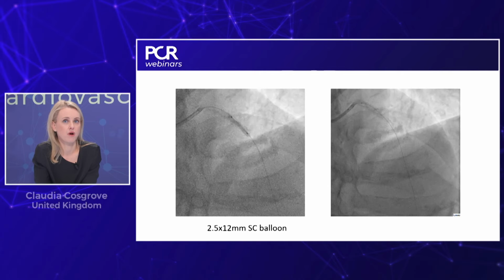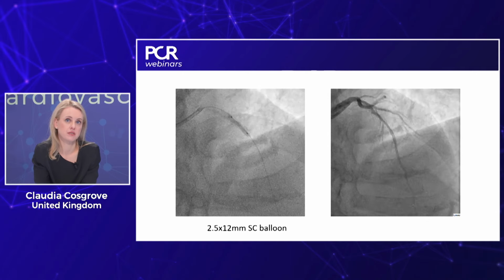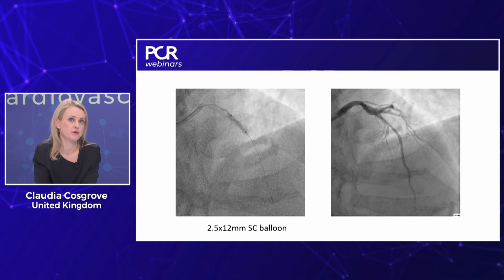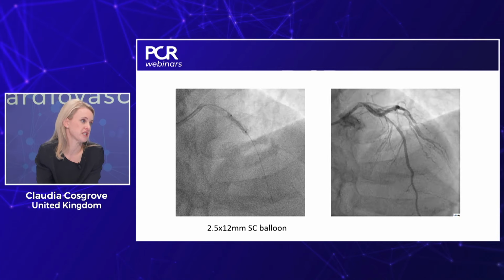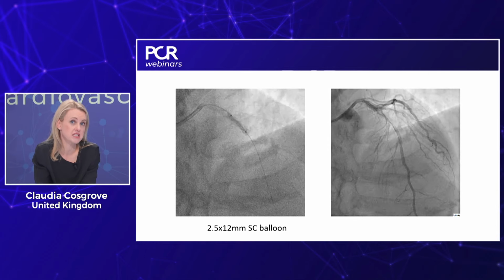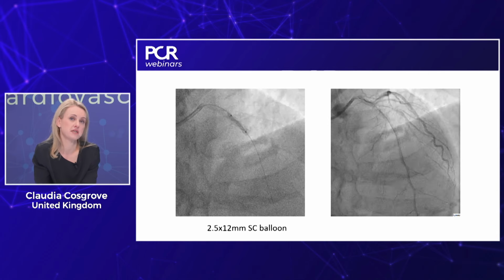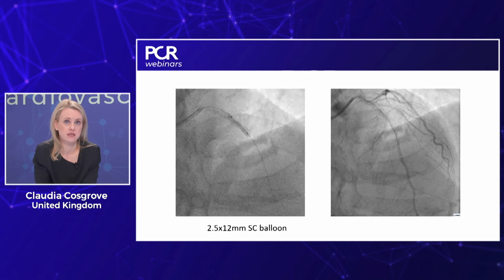I think you can see on the angiogram on the right that there's at least moderate calcification, based on the angiographic appearance of calcium before the dye enters the artery. I think that 2.5 millimetre balloon, although it's undersized for the vessel, you can appreciate that it's underexpanded. So I'm suspicious at this point that there's at least moderate calcium that's going to need to be modified before we can put a stent in this vessel.